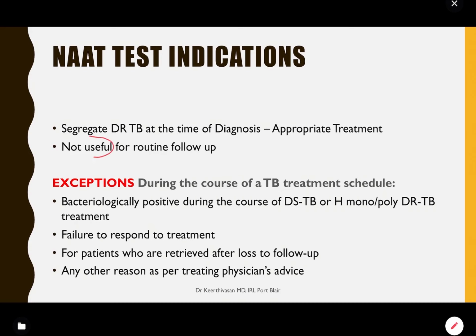So it is not much useful for routine follow up. Why? Because this is a genetic test. It basically detects DNA, part of DNA, genes in DNA. Routine follow up is not useful because when you are giving drug, the bacteria may be dead inside, but the DNA will be present in the sample. So even a dead bacteria which is present inside the body can give a positive NAT test. That is why it is not done for routine follow-up.